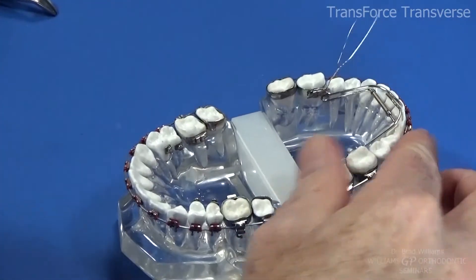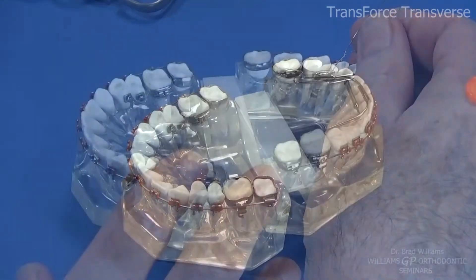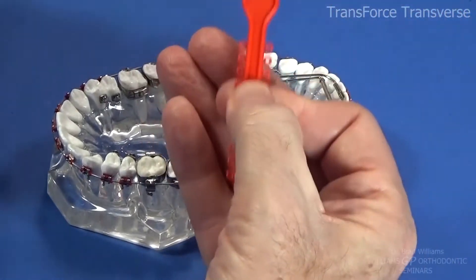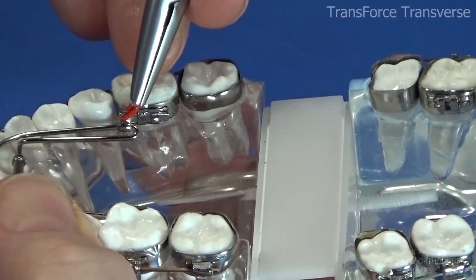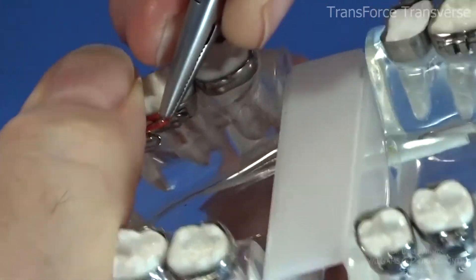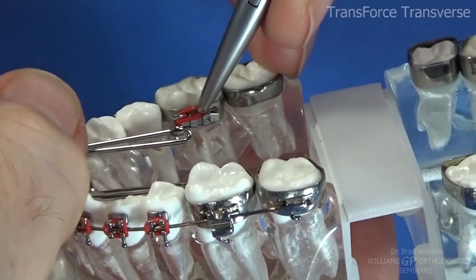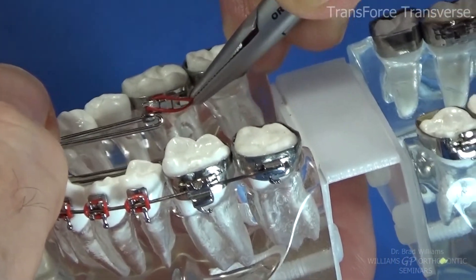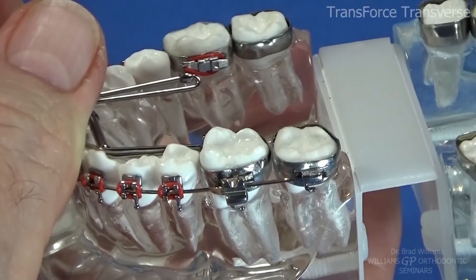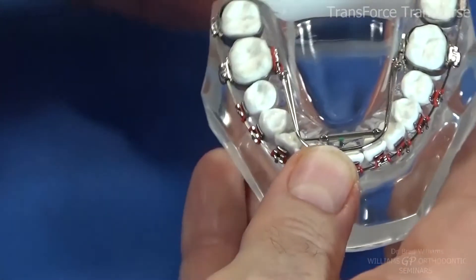The other way is to use a glide tie. Go ahead and clip the steel ligature and tuck it out of the way. Then get a glide tie, catch that hook — that little knob they give you — and just stretch it over the tongue like that. That will hold it in. Either one of those ways is perfectly fine.